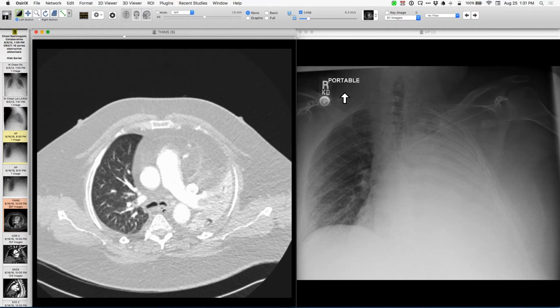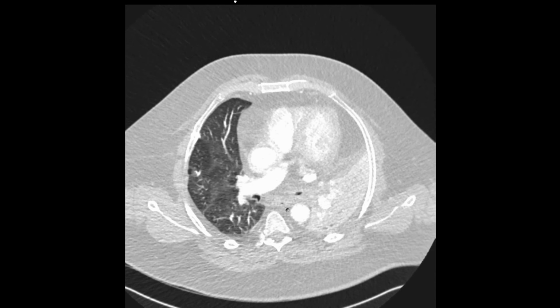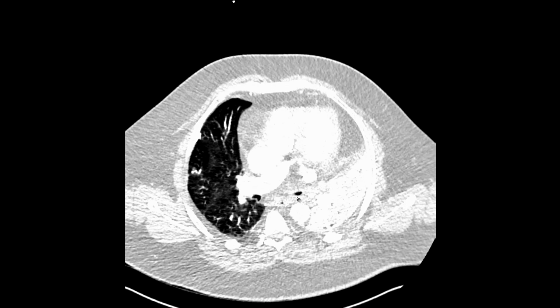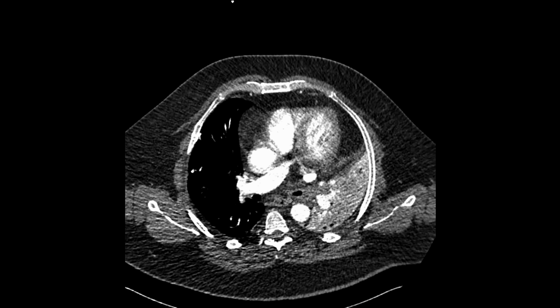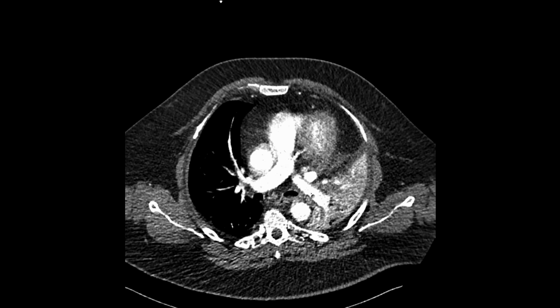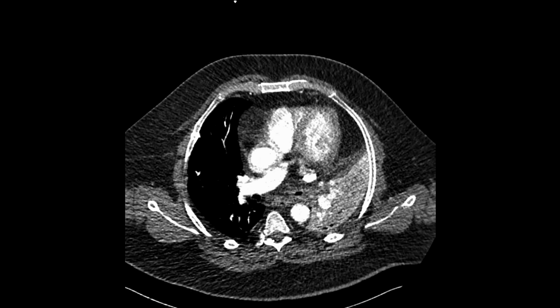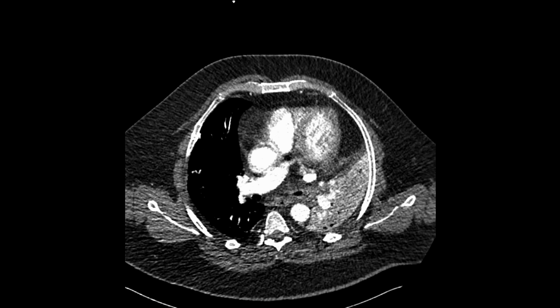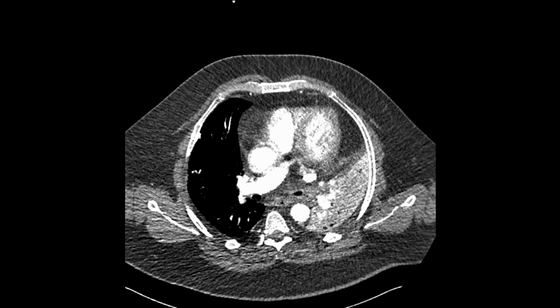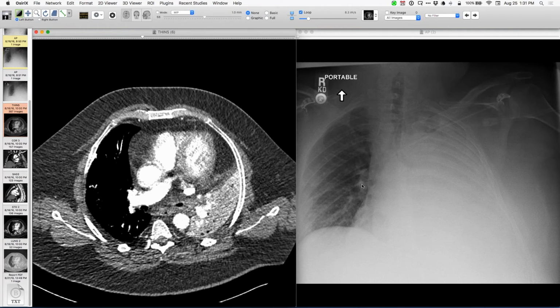Down the left main, which is going to peter out pretty soon right there. And then looking at it right there and trying to discern the presence of an obstructing lesion like a mass or extrinsic. Not really. It just tails off into nothing. And then, of course, the question is what is sitting right in there producing this atelectatic lung? And the answer to that is right here.